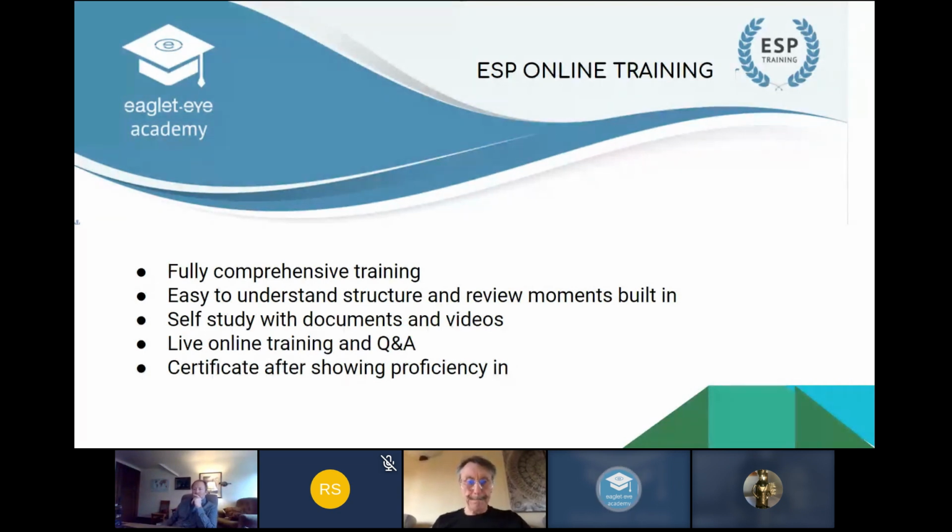This is a consequence of the whole Corona situation that we all find ourselves in. We used to come to each practice for in-place training, and of course that's impossible now with all the travel restrictions. So we have just finished creating full comprehensive online training, and we'll roll that out with a couple of our customers who have just been delivered their ESP.